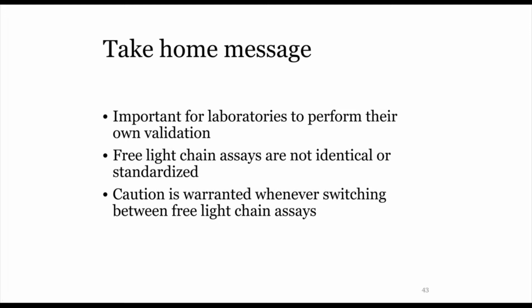Now, the one thing that the Binding Site has going for it is that it has a lot of clinical studies behind it. As I showed in some of the previous slides, let me just scroll back to this slide. Hold on. So this is a slide that I wanted to show. The interpretation of serum free light chain results: there have been quite a few large studies that came up with this 100% diagnostic range that shows that people who fall within this narrow range for kappa lambda ratio essentially do not have monoclonal gammopathies, whereas anybody that falls outside generally has either an MGUS or multiple myeloma.